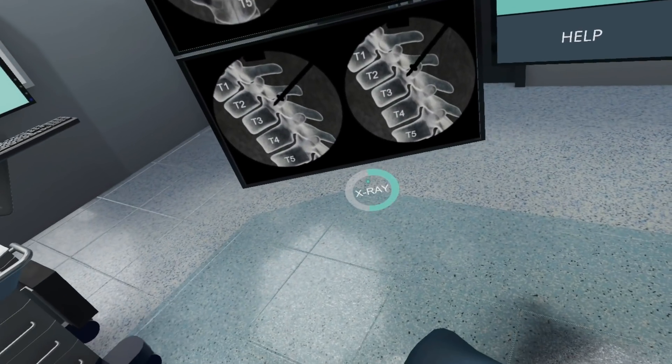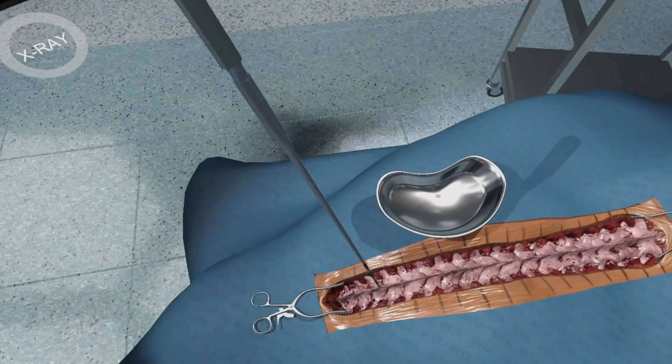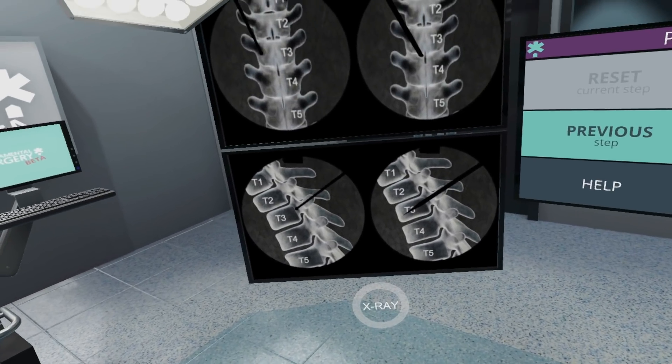Let's x-ray and see how I've done. Now I have a feeler so I can check the integrity of the channel and see how well I've done. And that's complete.